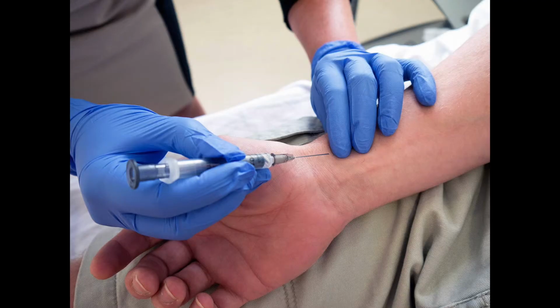Now, common indications for the use of an ABG include issues with lung function, kidney function, patients presenting in shock, post-trauma, with uncontrolled diabetes, in asthma exacerbation or exacerbation of COPD, patients that have experienced a drug overdose or are experiencing metabolic disease, chemical poisoning, or current infection or sepsis.